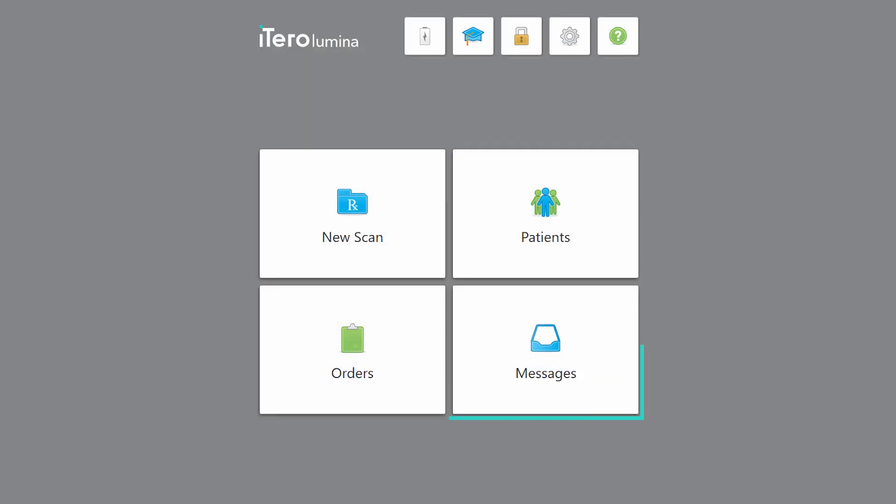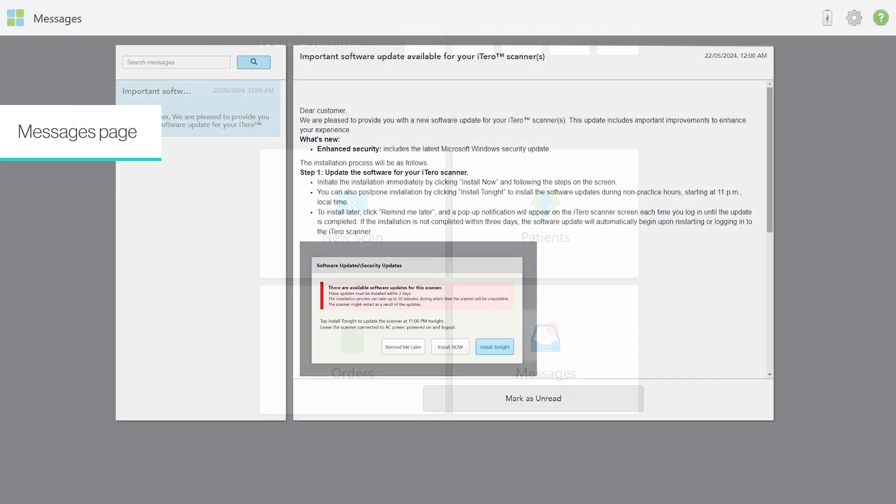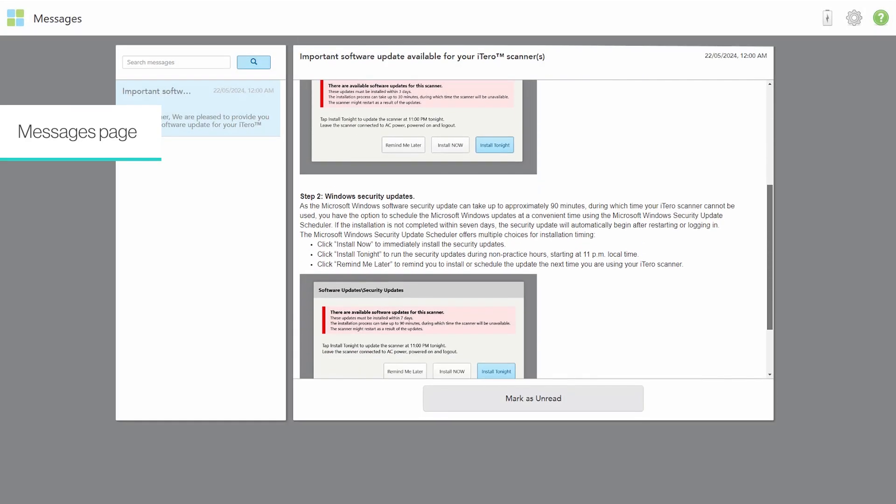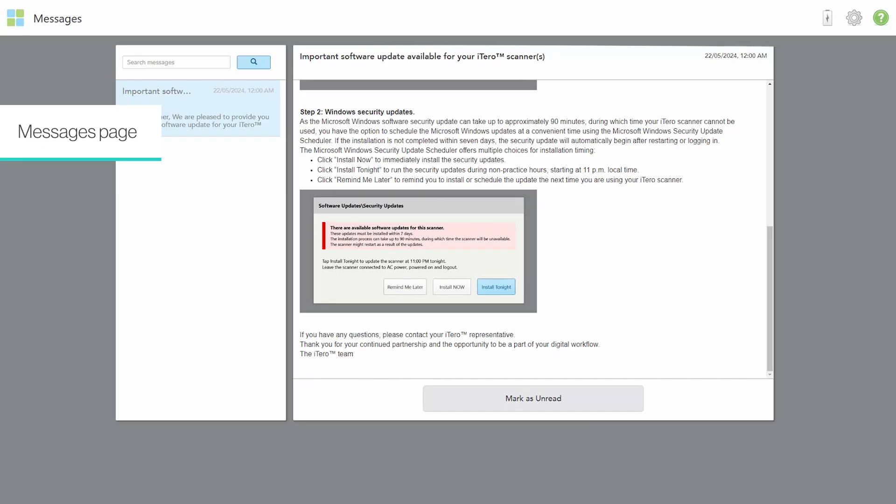Tap the Messages button to view your messages. A badge will indicate how many unread messages you currently have. The Messages page displays notifications, updates, and other system messages from Align Technology.